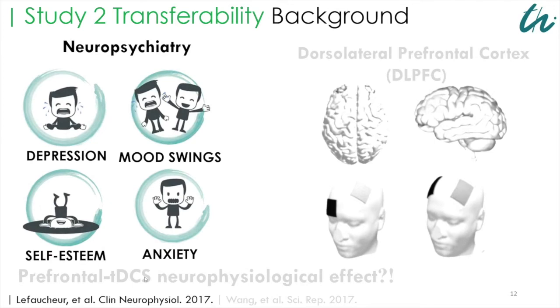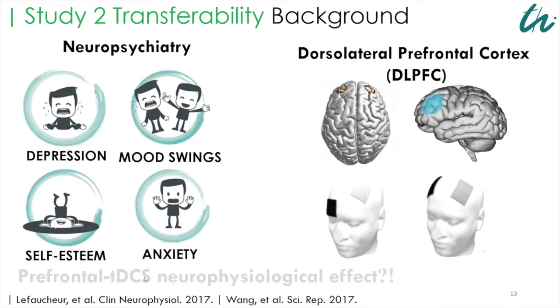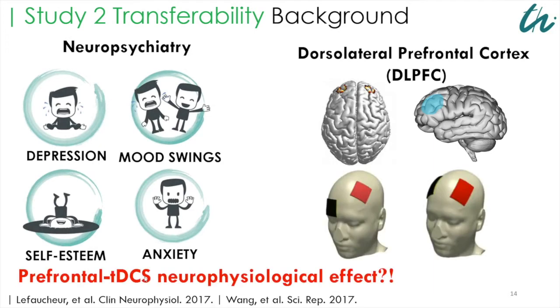tDCS has been widely used to alter the symptoms of different neuropsychiatric disorders, with the dorsolateral prefrontal cortex as the main targeted region. But much less is known about the tDCS neurophysiological effect over the DLPFC.